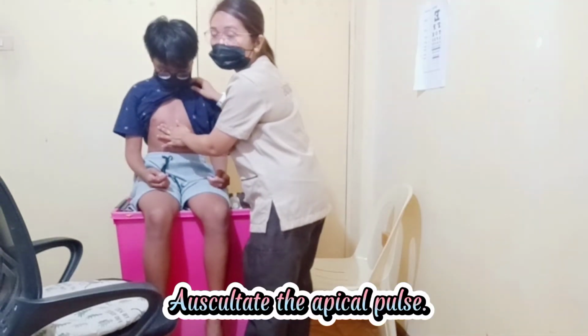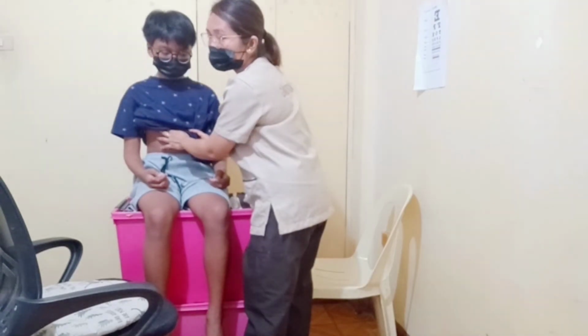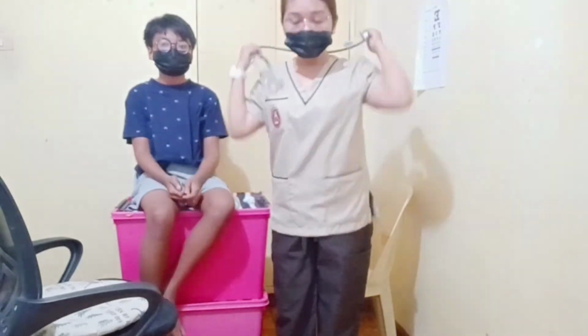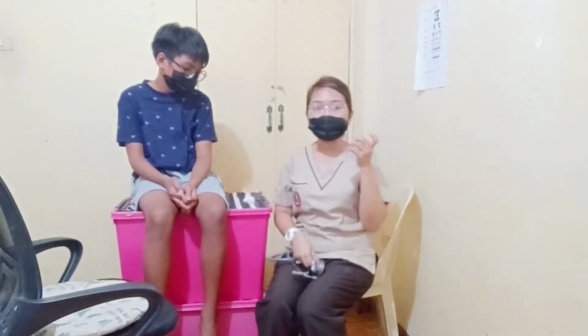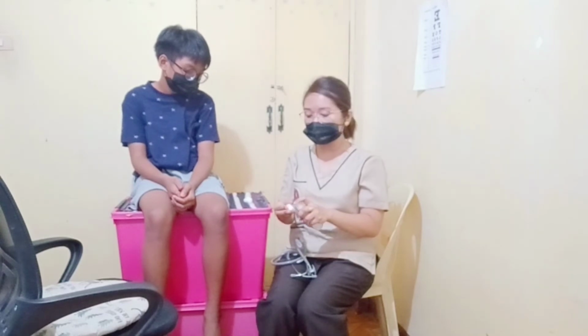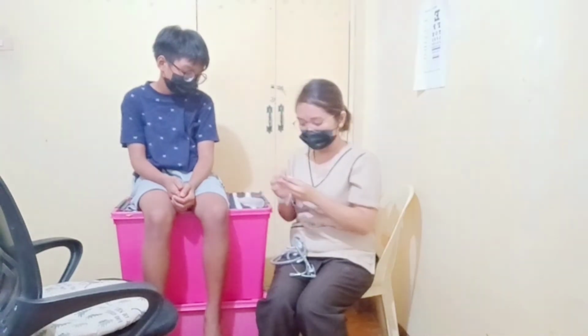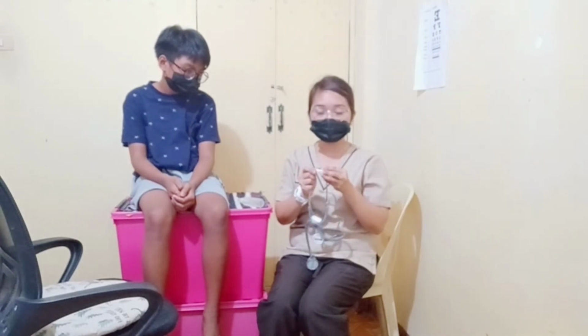Okay, so now we are going to auscultate. Later on, we're going to auscultate the apical pulse of the patient. But before that, before we use the stethoscope, we have to make sure that we disinfect it. Okay, so using an alcohol and of course a cotton ball, we have to make sure that we clean the earpiece.